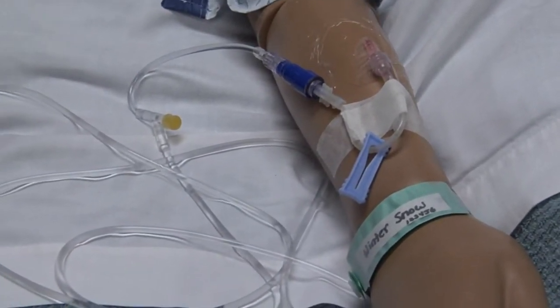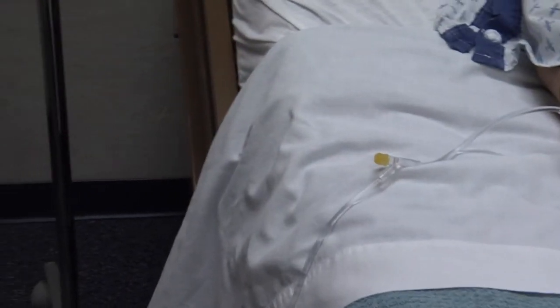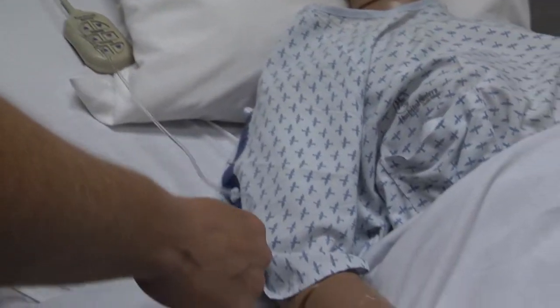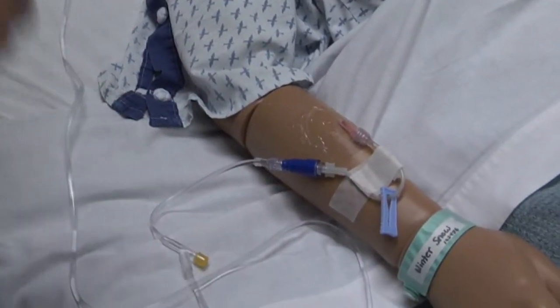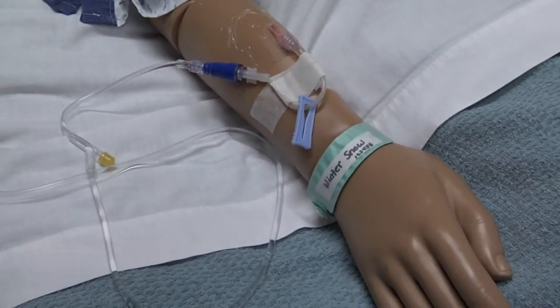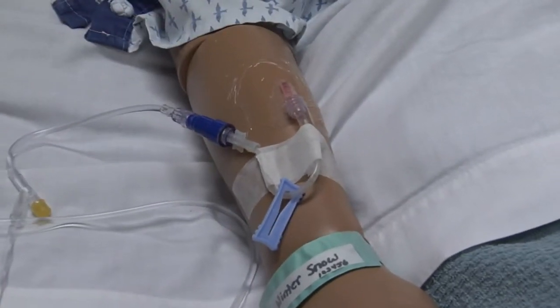So when I come in, I want to make sure that the tubing is not hanging down like this onto the floor with big dependent loops. If that was the case, then I would just pick it up and coil it back up onto her bed so that the tubing isn't in her way and it's not going to be pinched or kinked at all. So then we work our way down to the IV site itself.